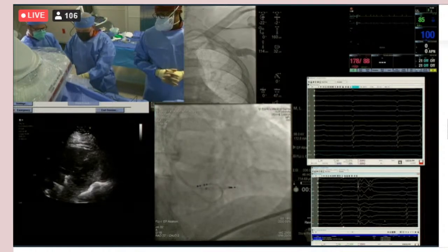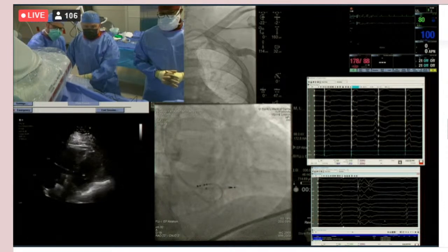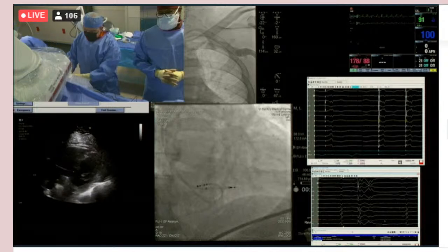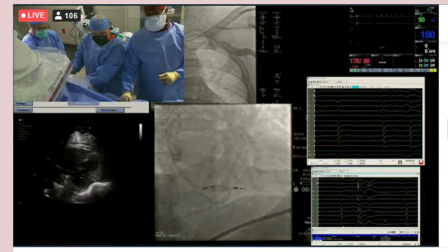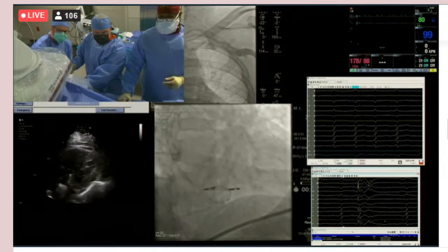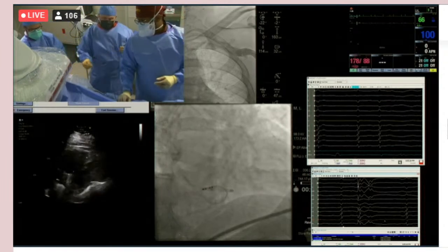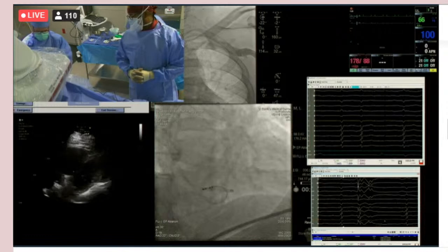In the QS, you're referring to which signal? The blue signal there? Now, if you look at the yellow one, see how the yellow has that little, it looks like a W. Yeah. I'm going to go, we may be not in the right spot, so I'm going to start over. Again, this is one of those things where if it doesn't go easily, don't fight it. It just needs to be in a different position.